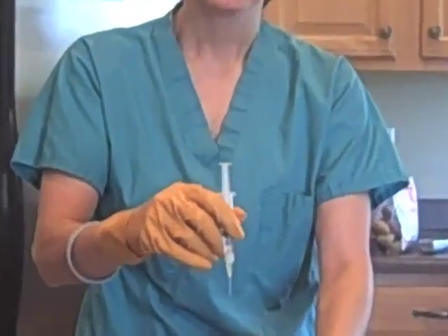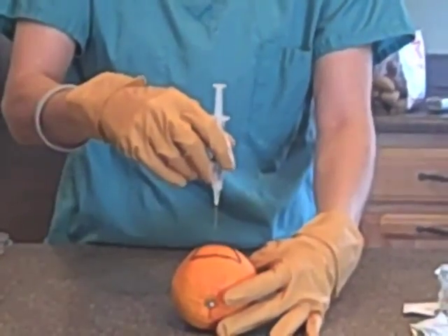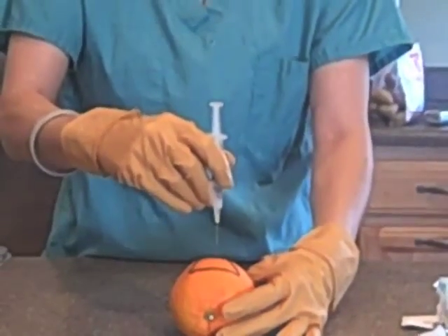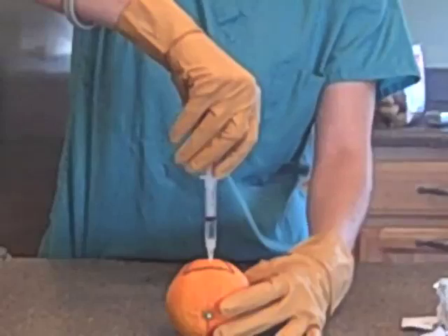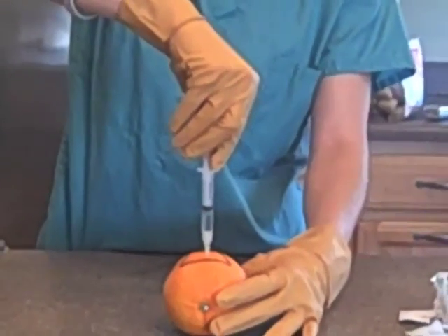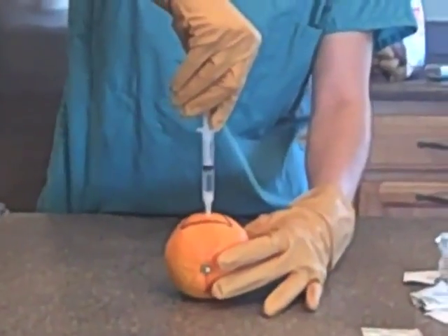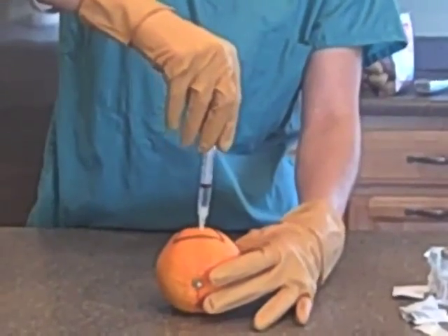By this time, the area is dry from the alcohol swab, and we take the needle and we position it so it's at 90-degree angle from the skin, or perpendicular angle. Then we quickly plunge into the site. We pull back to ensure that we're not in a small vessel, and the way we determine that is that if we pull back and we see blood, we know we have to take the needle back out and redo the whole process again.